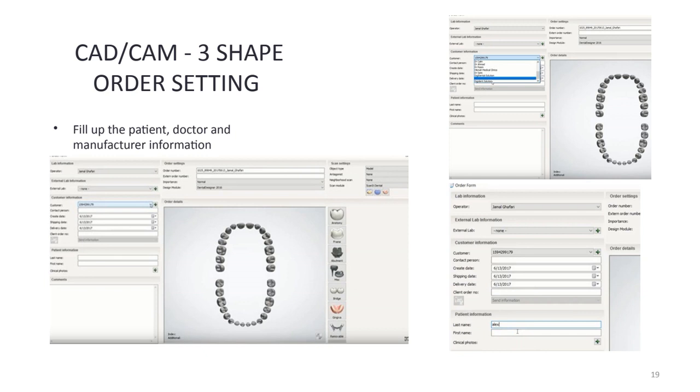If we don't have, especially the alignment, the bite registration, how the patient bites down, right? The software doesn't know how to put the upper and lower together. So when we start working on the case, the upper and the lower can be in a different position, and that's going to mess up the whole case. So it's very important for us to be aware that during the scanning procedure, we also have to register how the centric relation is in the patient's mouth. Okay.